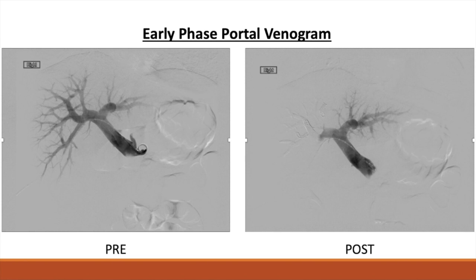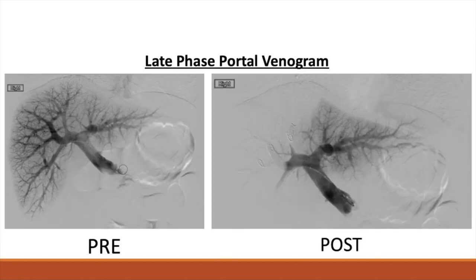In the next three slides, we see side-by-side comparisons of pre- and post-embolization portal venograms to better demonstrate what stasis looks like. As you can see, since the coils have been placed, there is little to no blood flow entering the right lobe of the liver, which is the goal of the procedure.